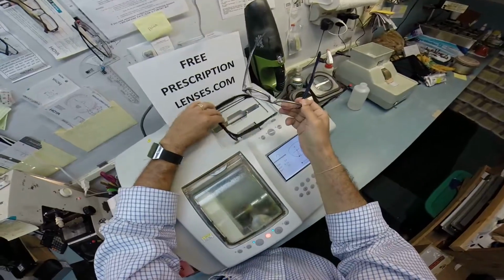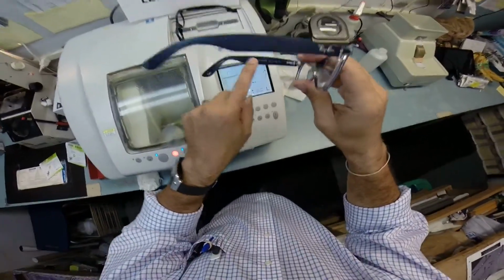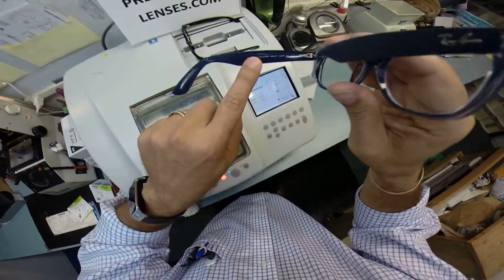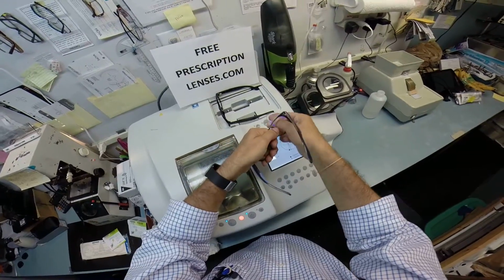And every day I pop my lens into a different color depending on what I'm wearing. Today I'm wearing color code. I can't see it because I got my glasses off, but it should be the 6053. So again, I use my thumb on top of the other thumb, push down.